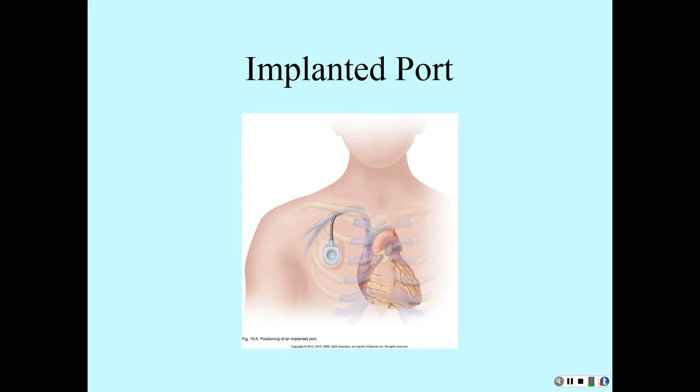All right. You may have a patient with an implanted port. These are ports that are surgically placed and tunneled up into the central circulation. They're usually on the chest, the upper chest, or the upper arm.